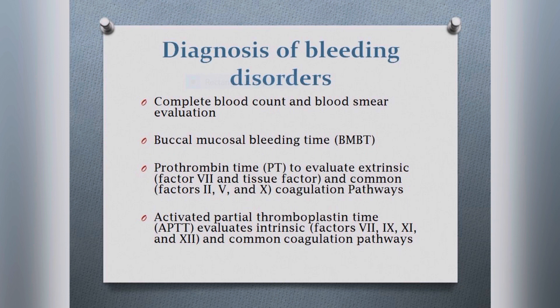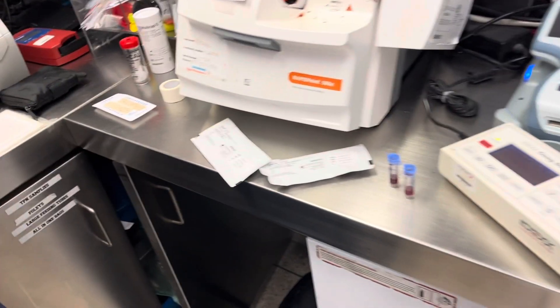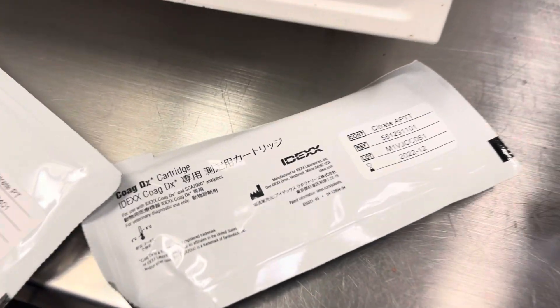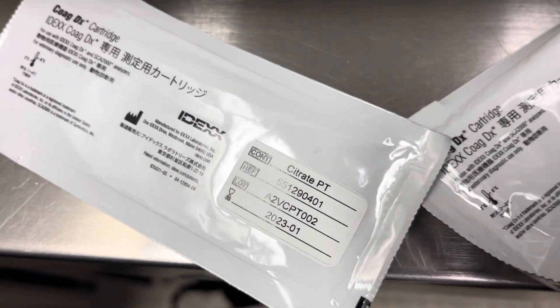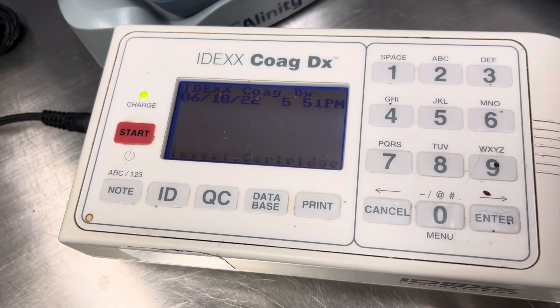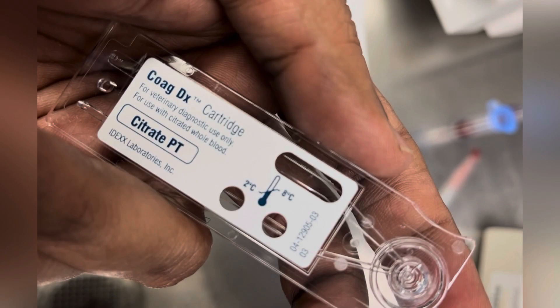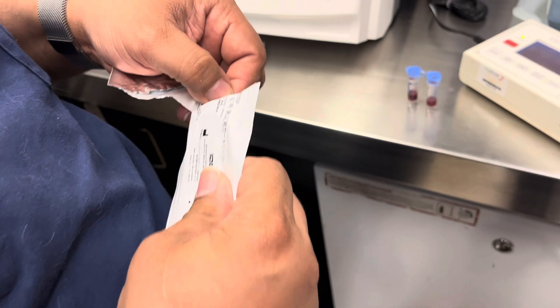There is a very useful apparatus called the IDEXX CoagDx. The process is very simple. We collect the blood in the sodium citrate vial — here we call it the blue-capped vial. We have two specific cartridges for the PT and APTT, specifically labeled the citrate PT and the citrate APTT cartridge. When the machine is turned on, it will ask to insert the cartridge. We take the cartridge and can see the end showing a circular depression where we have to put the blood.